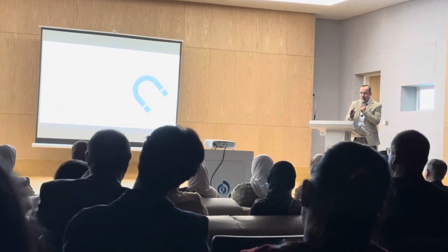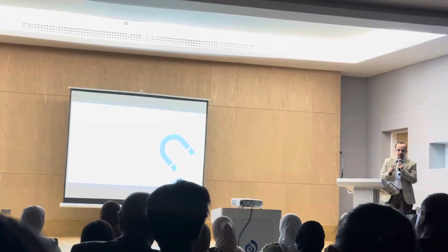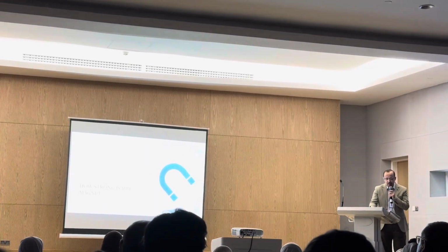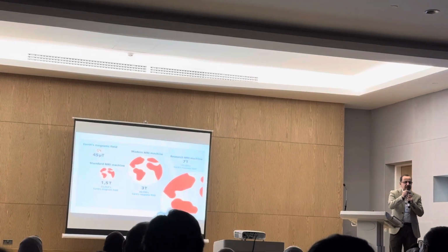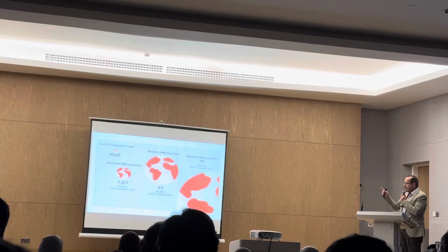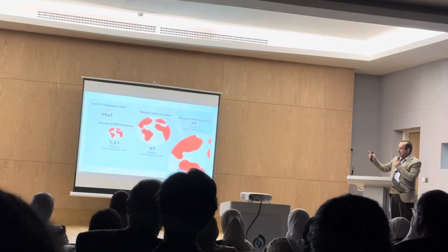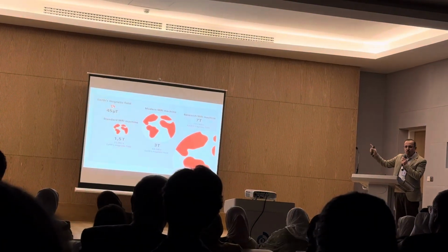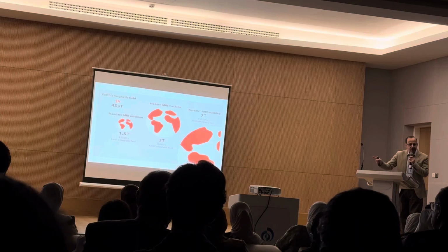The next question, which is related to our talk, is how strong is the MRI magnet? The answer is by comparing this magnet's strength to the Earth's magnetic strength at the Earth's surface. Our magnet, which is a 1.5 Tesla magnet, Tesla being the unit of measuring the strength of a magnet, is 33,000 times more potent than the Earth's magnetic strength at the Earth's surface.